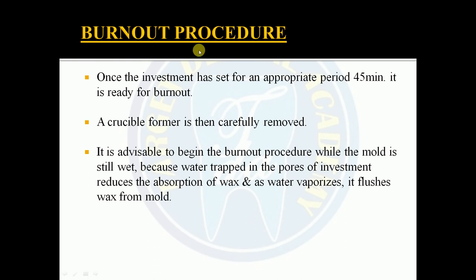Coming on to the burnout procedure, once the investment has set for the appropriate period, 45 minutes, it is ready for the burnout. The crucible former is then carefully removed. It is advisable to begin the burnout procedure while the mold is still wet, because water trapped in the pores of the investment reduces the absorption of the wax, and also the water vaporizes, which flushes the wax from the mold.